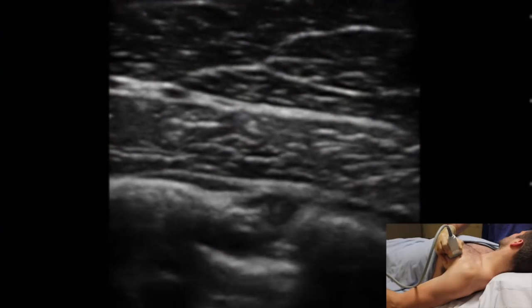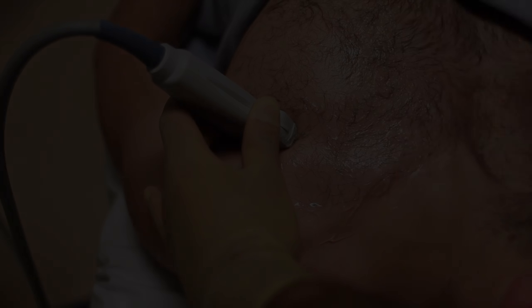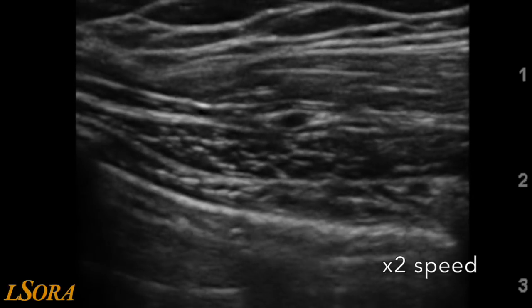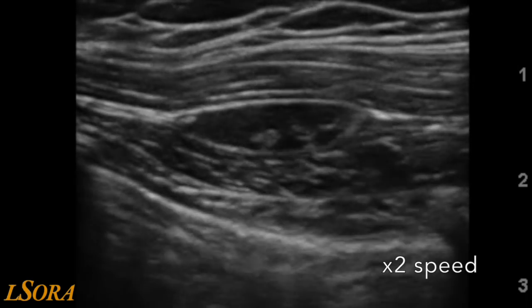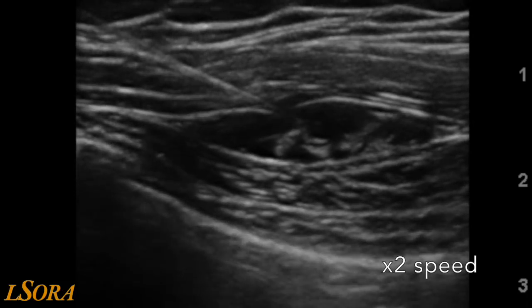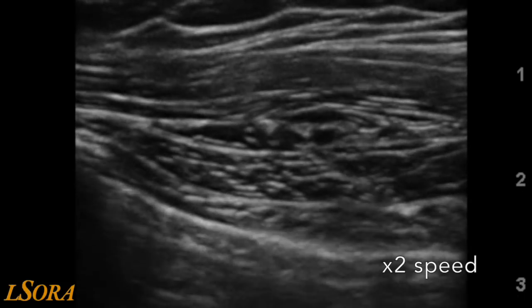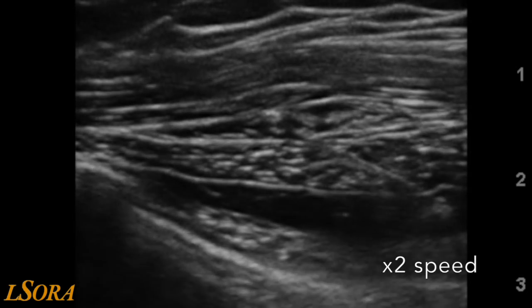At this point, this is the optimal position to site the pecs block. Shown here is the needle insertion point over the anterior part of the chest, directed laterally. In this block video, you will see the needle introduced from the left-hand side of the screen, from the middle part of the chest wall, directed laterally, aiming to identify the fascial plane between pec major superficially and pec minor deep to it. As the local anaesthetic is spreading, you can identify the two pectoral branches of the thoracoacromial artery and a hyperechoic structure on the left of them, which may well represent the lateral pectoral nerve. After 10 mL of local anaesthetic is injected, the needle is advanced through pec minor to identify the fascial plane between pec minor and serratus anterior. Injection of 20 mL of local anaesthetic here is causing this fascial plane to open up, and local anaesthetic is directed laterally towards the axilla.